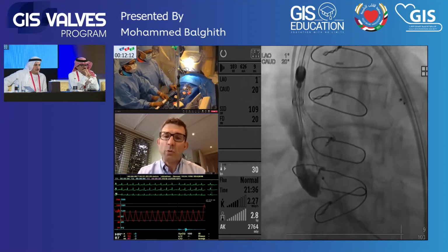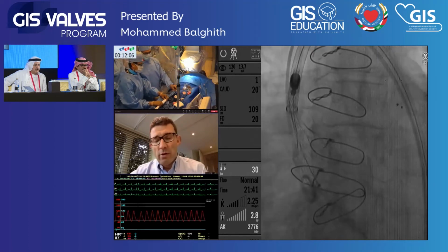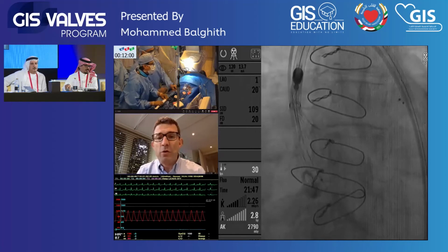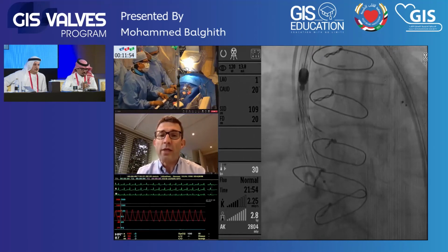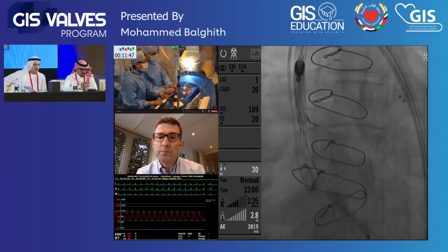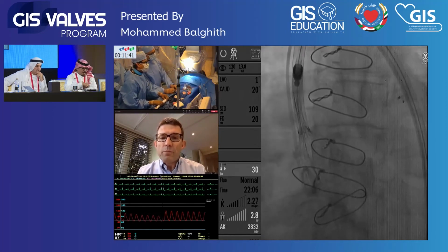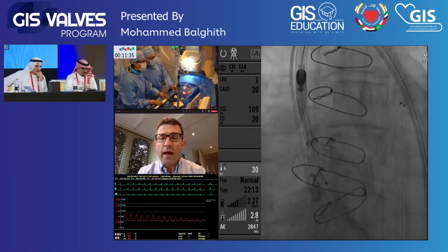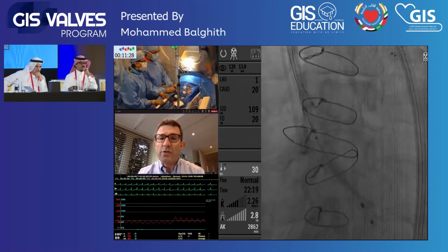So I think what would be sensible, stay in this view, do a partial resheath, and by turning the wheel obviously the other way, when the valve starts to collapse, you should be able to move it, I would say, probably about 2 to 3 millimeters into the left ventricular outflow tract, and I think that will then be an optimal position. Excellent. And what I like from this is the hemodynamics, blood pressure, everything stays the same. We have little compromise of the hemodynamic stability of the position, it's beautiful. It's very good. I think for people, particularly if they have impaired left ventricular function, to give them a hemodynamically stable procedure is very advantageous.